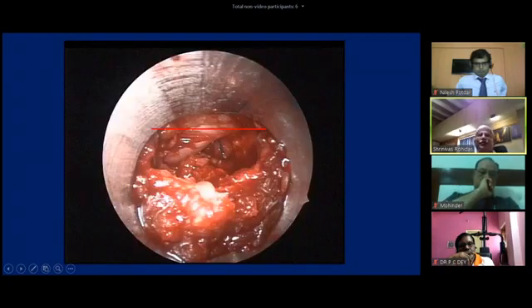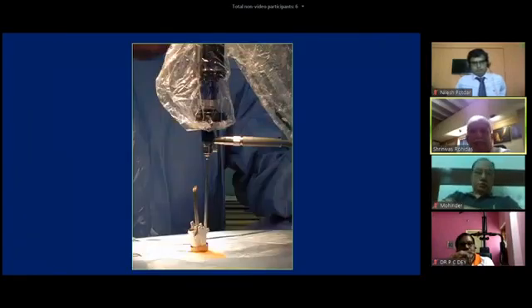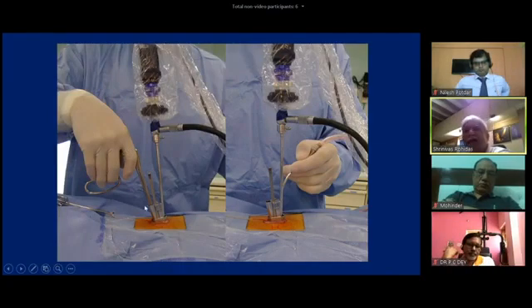This is the endoscopic view when we put the endoscope, the outer tube, inner tube inside and have a look at the screen. This is the outer tube, inner tube, endoscope, light cable with the camera. Then we use suction in the left hand. We use the left hand with the suction to stabilize the system. This is the second stabilizing force with the instrument in the right hand.